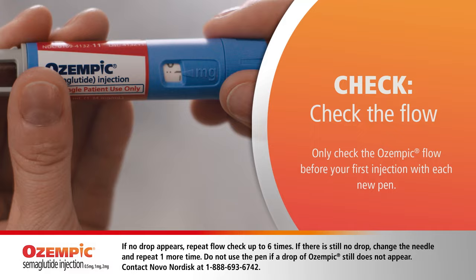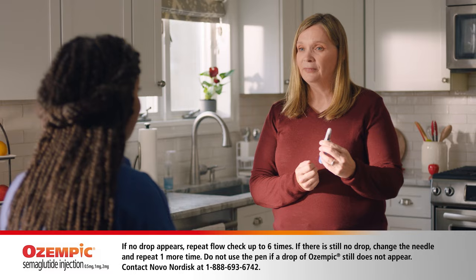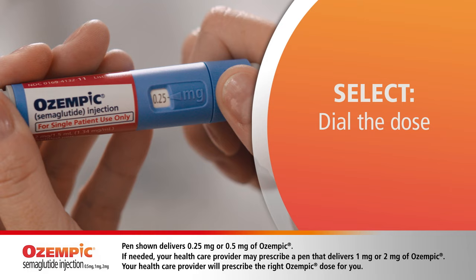Since it's a new pen, I need to check the flow. So first, I turn the dose selector to the flow check symbol. Next, press and hold in the dose button until the dose counter shows zero, and the zero must line up with the dose pointer. A drop of Ozempic will appear at the needle tip. Looks good.